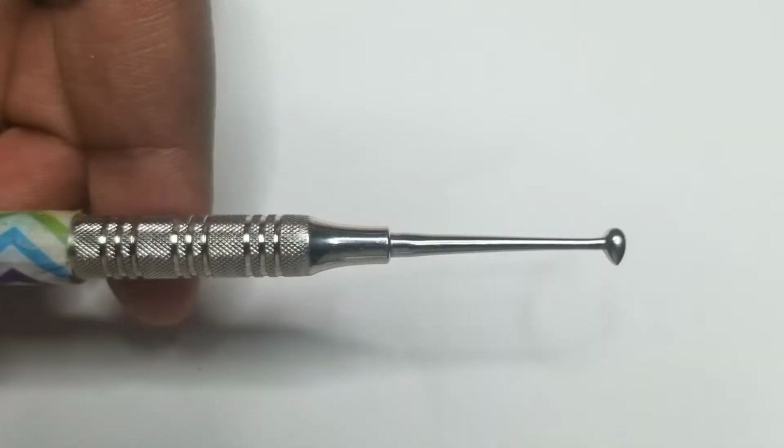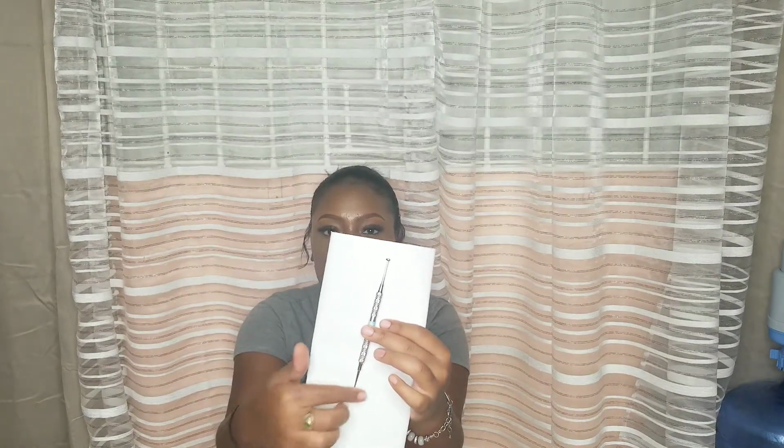This one is called the American football burnisher. It looks like an American football, hence the name, both ends shaped the same way. Mine has both ends the same size, but you have some where one end is smaller than the other. If you can get that one, I definitely recommend it over this one, because what's the purpose of having a two-sided instrument if you have the exact same thing on both ends?